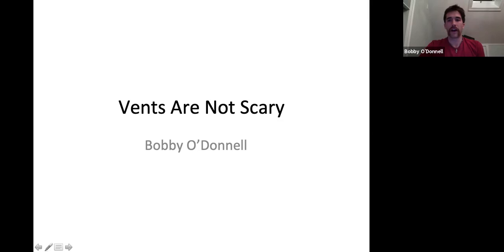So I understand that even in my paramedic education, in the initial schooling, we didn't go over ventilators. And when you suddenly go into an environment where you're using them, it can be a daunting task. And I understand that, and I appreciate that, because it's a high acuity and a low frequency skill, similar to intubation. And when we're doing this, we need to be sharp with it, and we need to be doing things efficiently and appropriately.